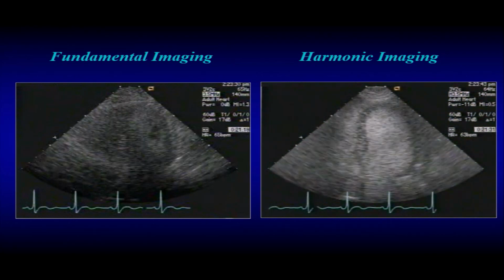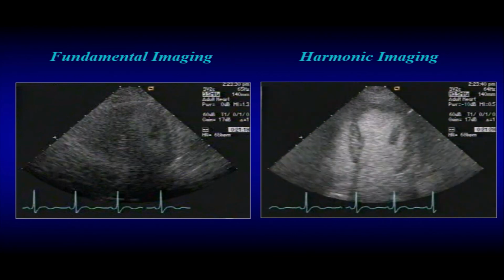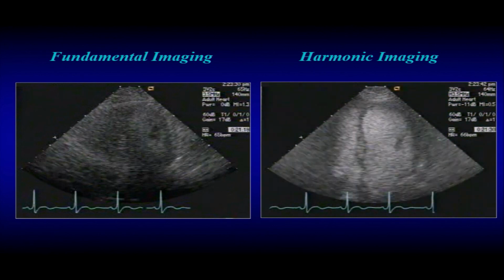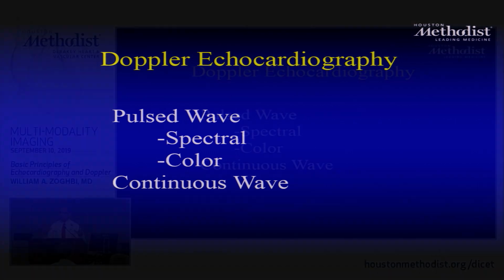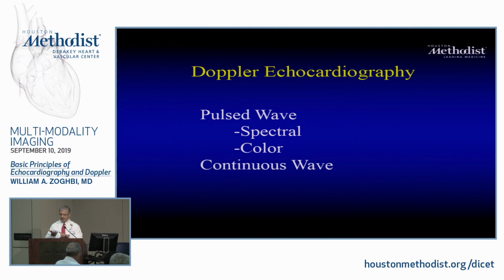And the image is much more enhanced. And then you can have a nice contrast between the myocardium as well as the contrast itself, okay? So this is fundamentals of 2D imaging. Thinking about frequency, okay? Think about harmonics.